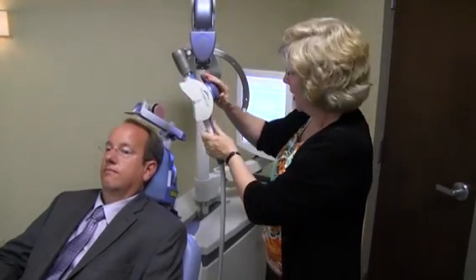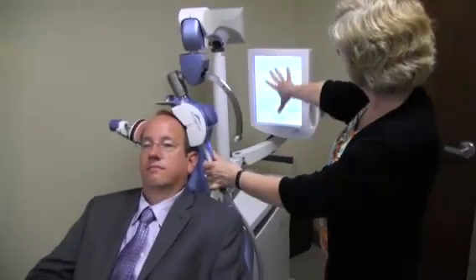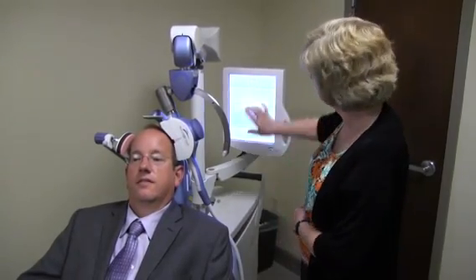This is the coil, and it's going to make a little clicky noise because it has an air brake. We would put all of those parameters in here for how high, low, forward, back, and how much magnetic current was necessary, and then we would start treatment, and it would make a noise that I can't replicate here, but it goes tap tap tap tap tap tap tap tap. Sounds a little bit like a woodpecker, and it delivers a burst for 4 seconds, and then there's a 26-second pause, and that cycle repeats every 30 seconds for 37.5 minutes. And then treatment's done, and the person can get up and drive himself home.